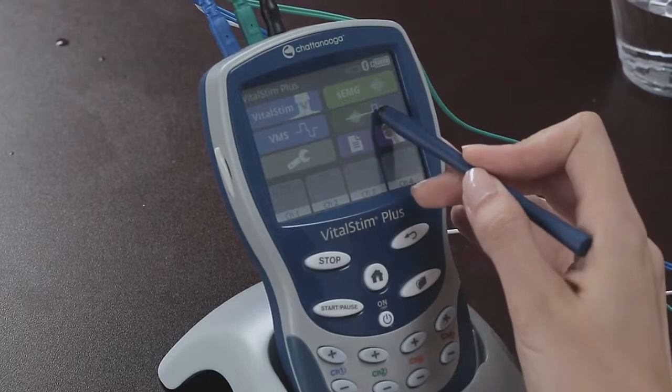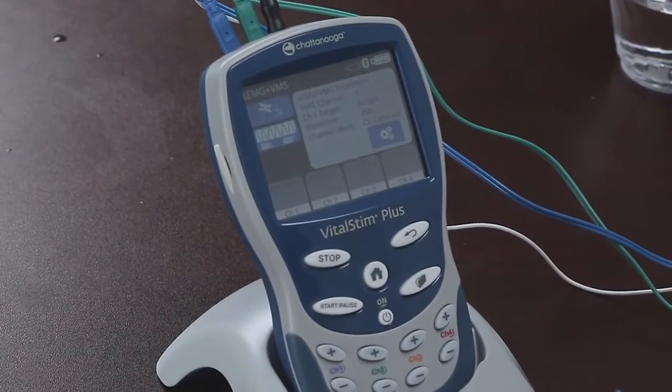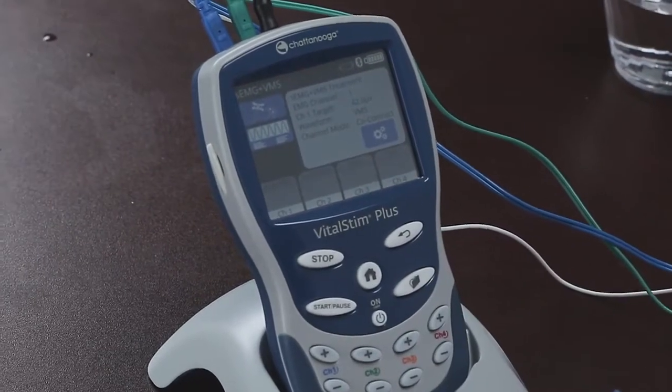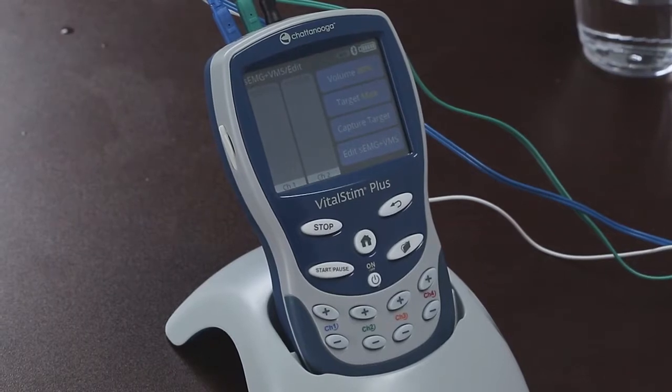Pressing EMG triggered stim from the home screen will get us in EMG triggered stim mode. In this mode, the patient is encouraged to work like before, but then when he reaches the threshold, the stimulation will kick in as a reinforcement of the effort. So pressing EMG triggered stim will get us to the point where we can set the parameters for both the stim and EMG. So let's press the gears icon, which is the setting button, to edit these settings.